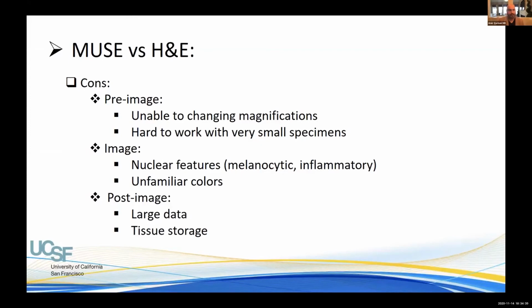And the interesting thing is, more recent graduate examiners were much better in diagnosing compared to my mentors, because they were used to two colors, and it was very hard for them to get familiar with these colors. But overall, it was a very impressive result.